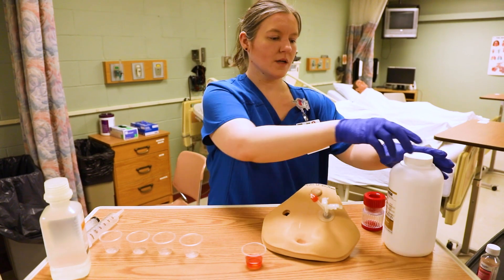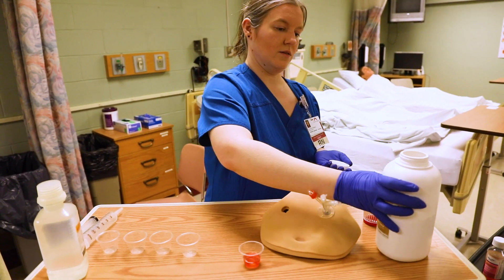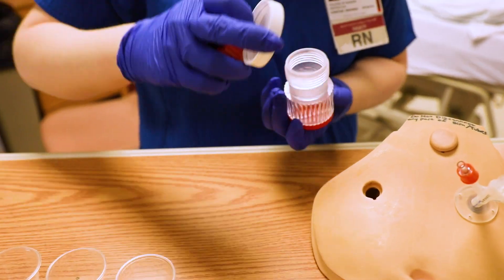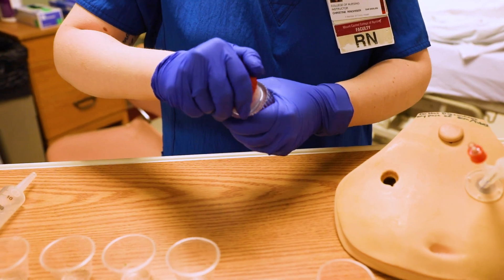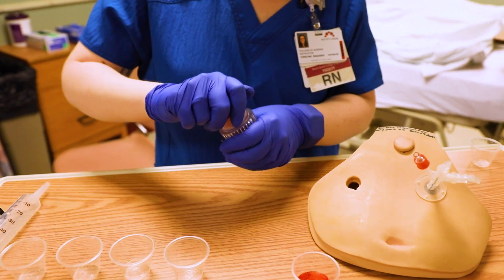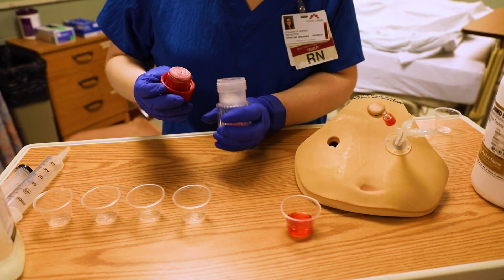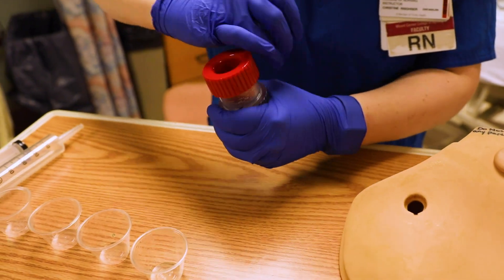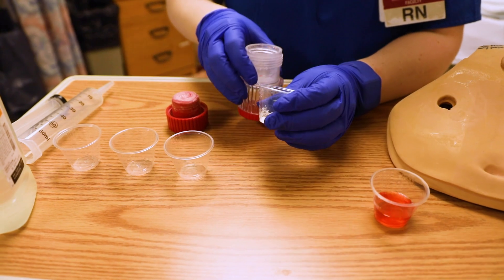Now I want to do the tablet. Put the tablet in the lid and use a pill crusher — make sure you always clean the pill crusher between pills because you don't know what's been in there. These crushers are single-patient use. You squeeze and keep wiggling it around. Remember, these tubes are surgically placed, so we have to make sure the pill is ground into a very fine powder. If there's still a little piece in there, break it up more.